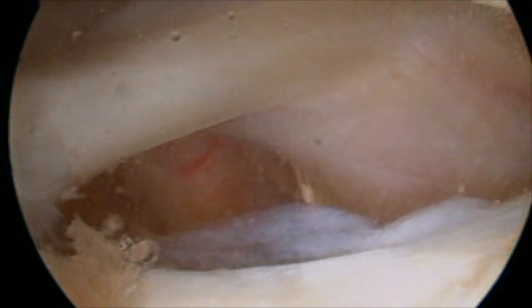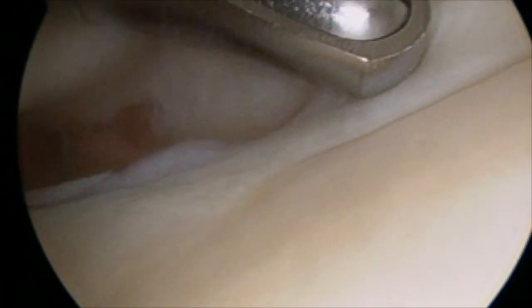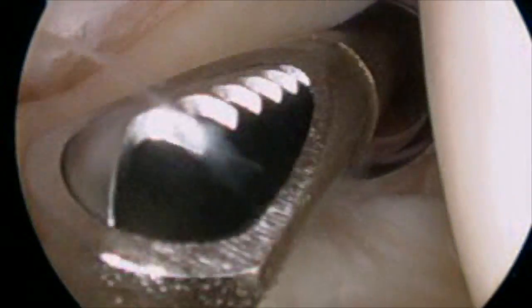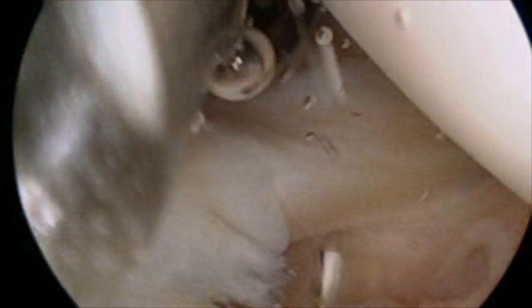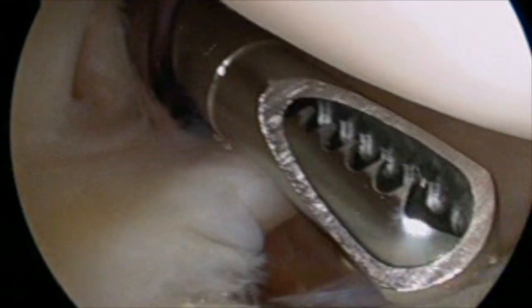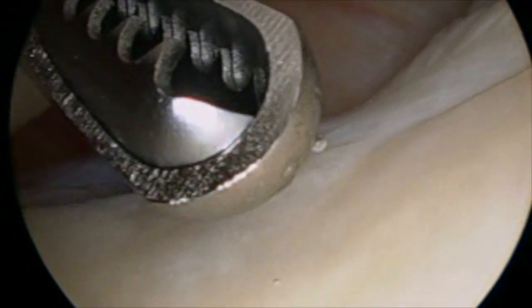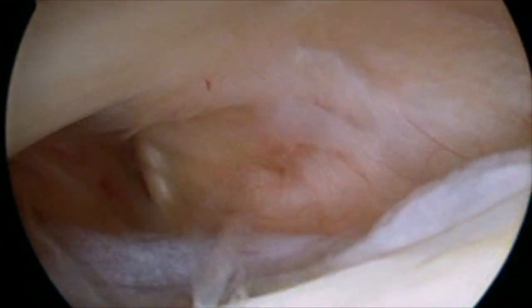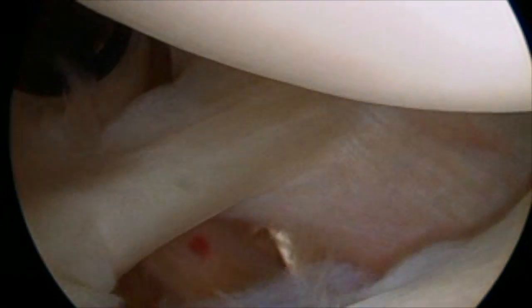Once the cannula is established, I can introduce what we call a shaver. What I can do is suck out the normal joint fluid, and then we have what we call an arthroscopic pump that pumps saline or salt water into the joint. You can see the picture is getting a lot clearer. So I kind of suck it out, refill the joint, suck it out, refill the joint. And then that gives us a nice crystal clear picture of the joint itself.